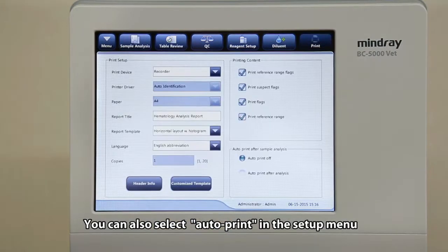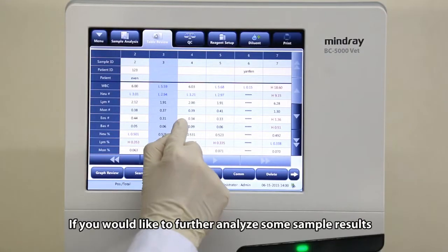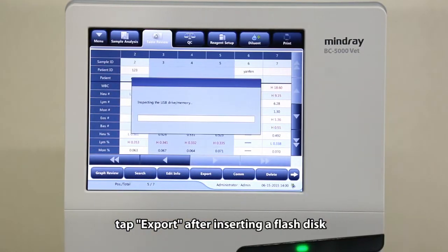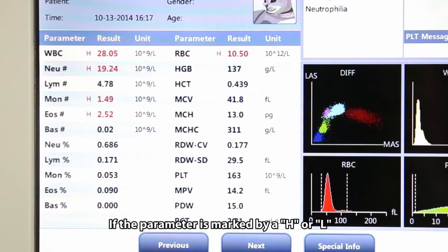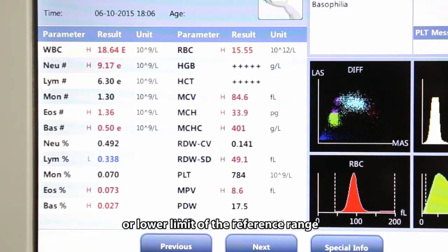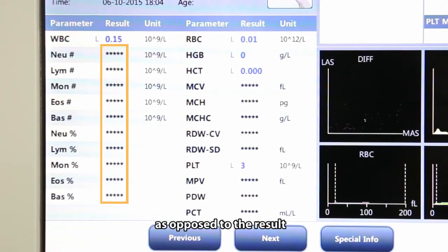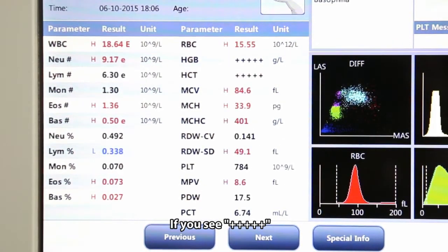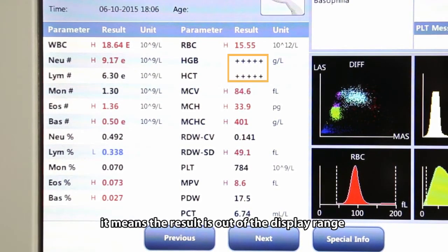You can also select auto-print in the setup menu to print out the report automatically. If you would like to further analyze some sample results, tap export after inserting a flash disk. If a parameter is marked by an H or L, it means the analysis result could exceed the upper or lower limit of the reference range. If you see ****** as opposed to the result, it means the result is invalid. If you see ++++++ as opposed to the result, it means the result is out of the display range.